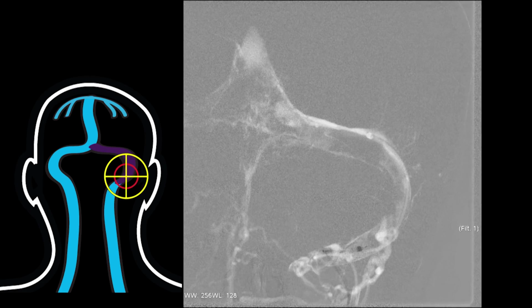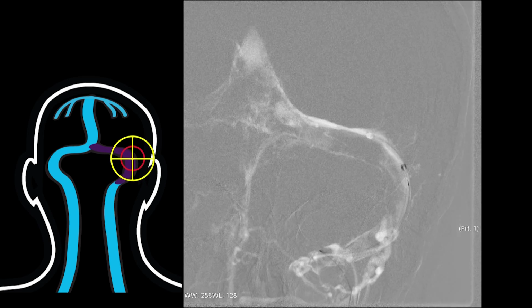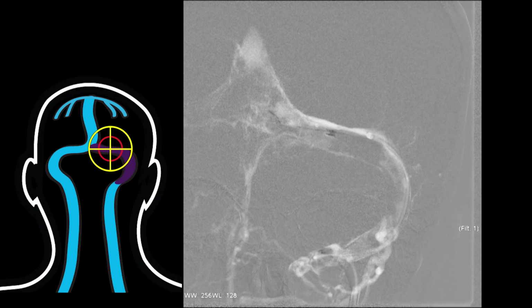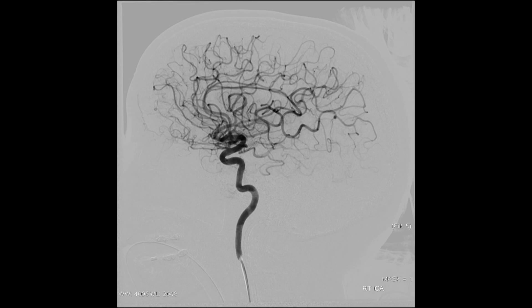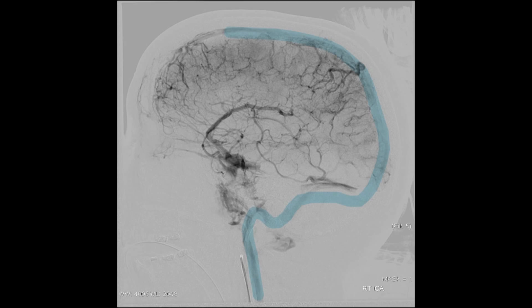Now I've moved the catheter to the sigmoid and transverse sinuses where the clot retrieval continues. After clearing clot from each of the venous sinuses, it is time to take another angiogram picture. Now the blood flowing into the brain can exit through the open venous sinuses shown here in blue.